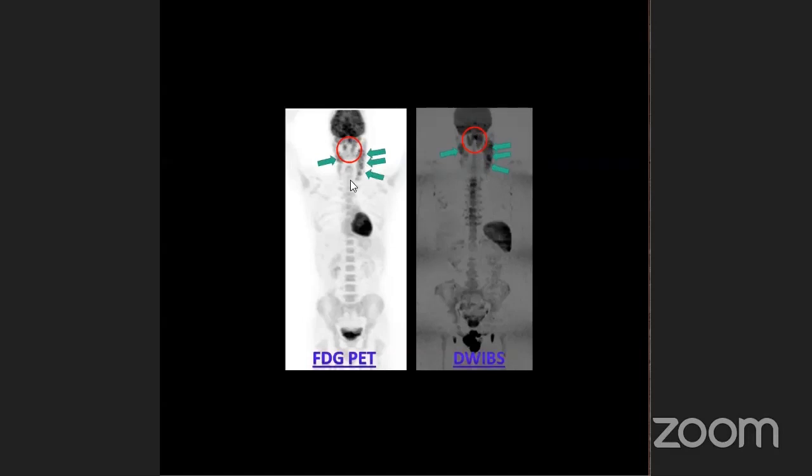And here, detection of metabolism: whatever you see that has high uptake in FDG, which is the most widely used tracer. So you will find that this is high uptake. And there are some pitfalls again, but it is a very useful tool you can use.